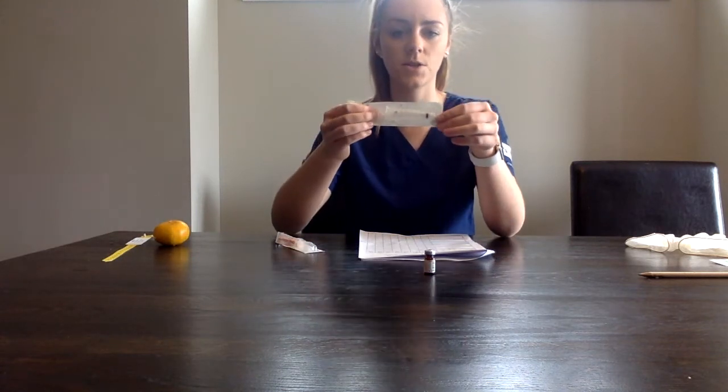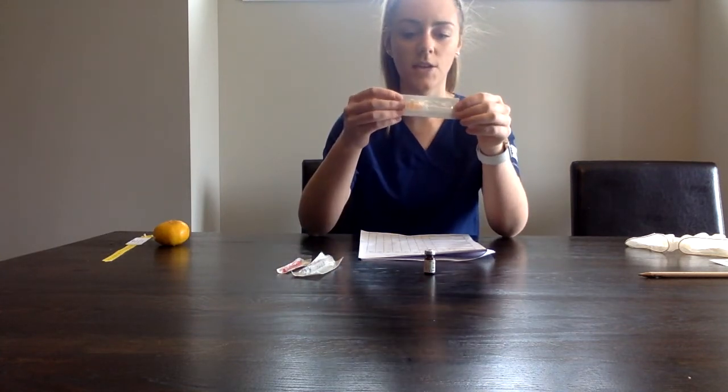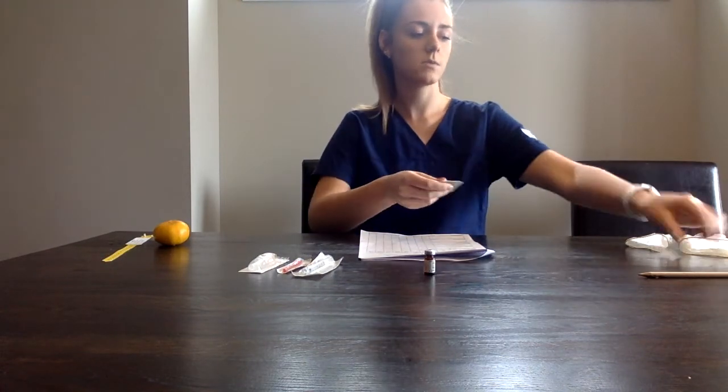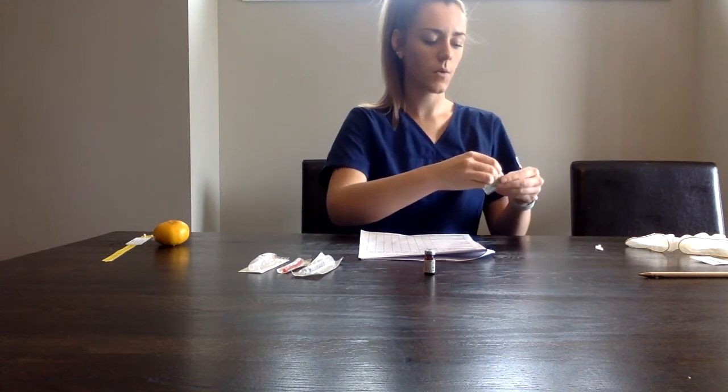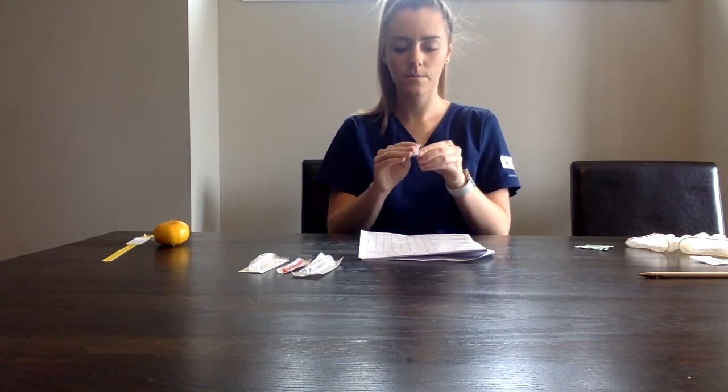The supplies that we'll need is a 3 ml syringe. We'll need a blunt-fill needle and a 25 gauge by 5/8 of an inch injection needle. So we'll do hand hygiene again, and we do need an alcohol swab. We're going to swab the top of the vial for 30 seconds.